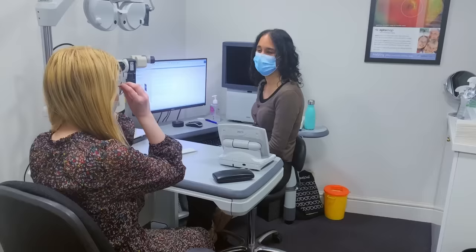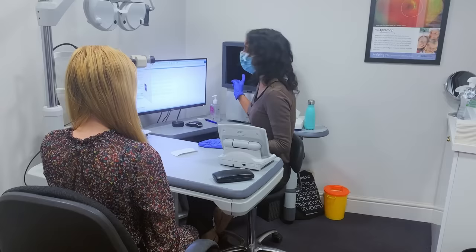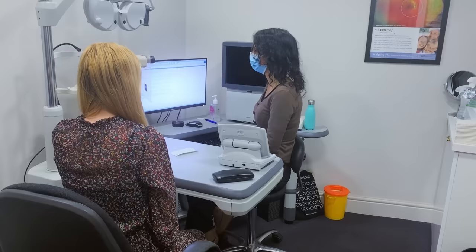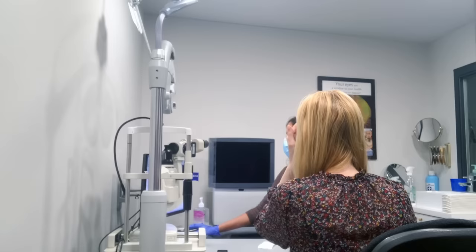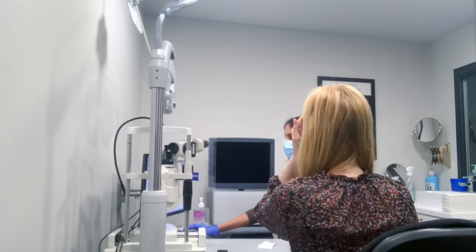Well, if I can ask you to cover up your left eye for me, just with the palm of your hand, great. So I'll bring the letters up on the screen behind me. What's the lowest line you can manage to read there? LCNK. Okay, very good. And you don't have to worry too much about the bottom, but could you make out any from the top or middle if you can? I think I can do the middle actually. V, F, L, N. Very good, excellent.